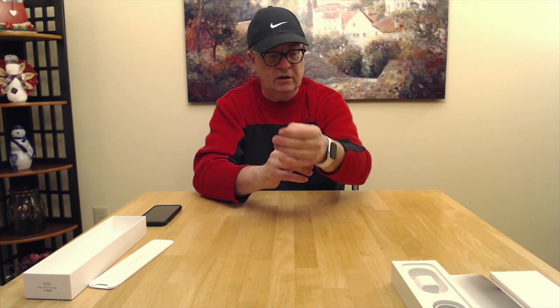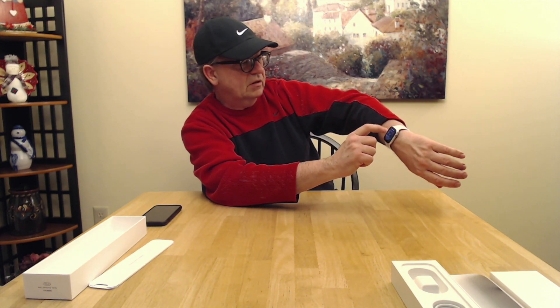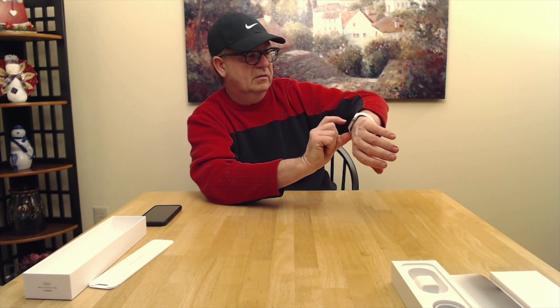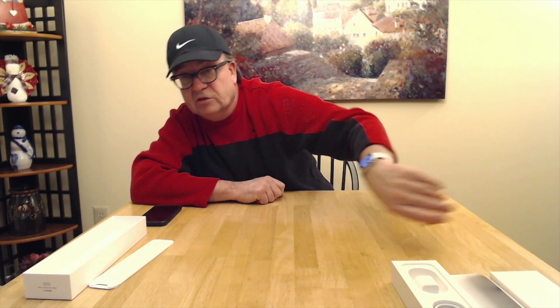We'll get it on the wrist here — secured on the wrist. Now we'll have to type the password in. Hit that button and punch your four-digit passcode in and you have your watch. That's the new main watch face — of course you can change it to any face you want.